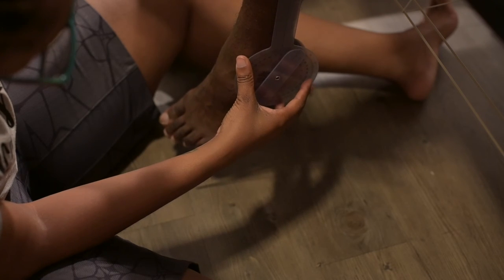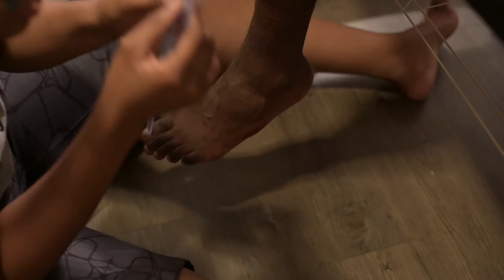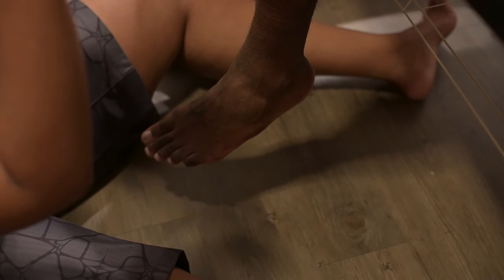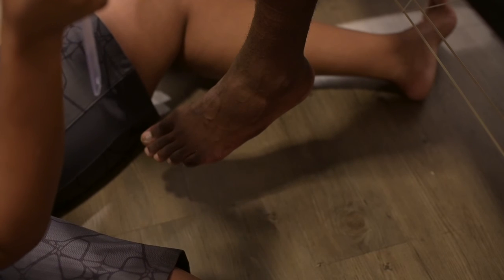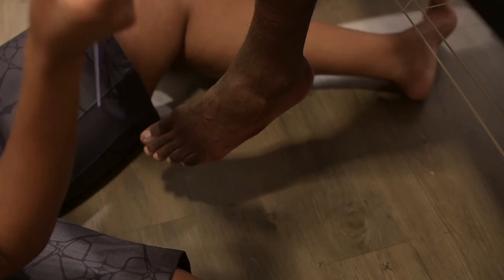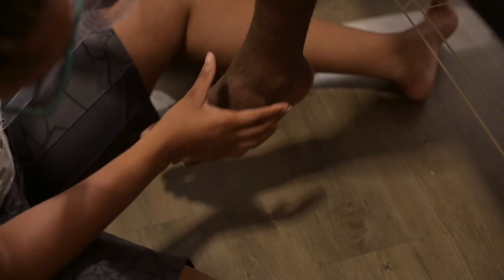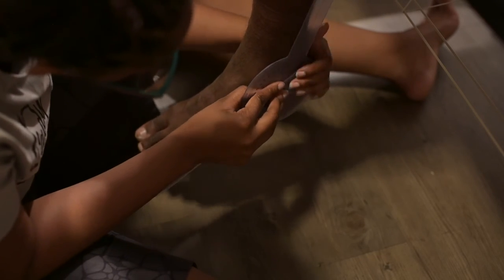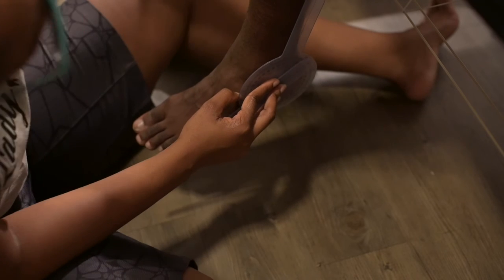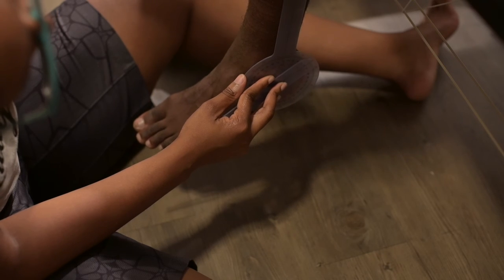Alright, so there's that. His measurement is wrong, so let's redo this. So again, lateral malleolus, axis of rotation, fibular head is here.